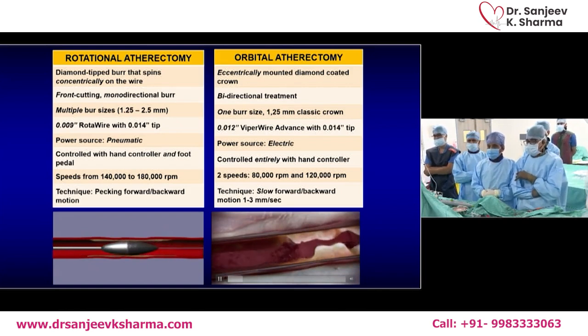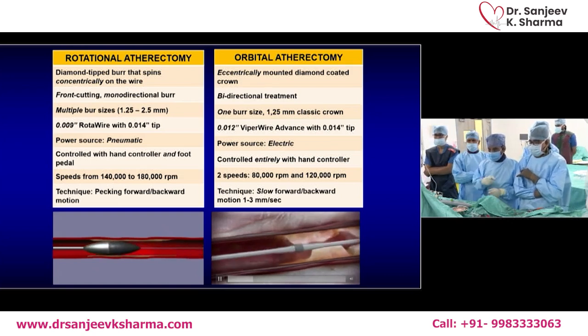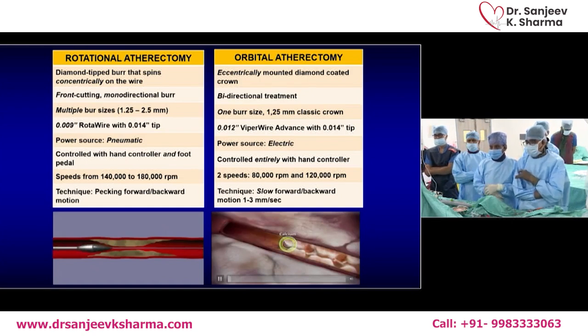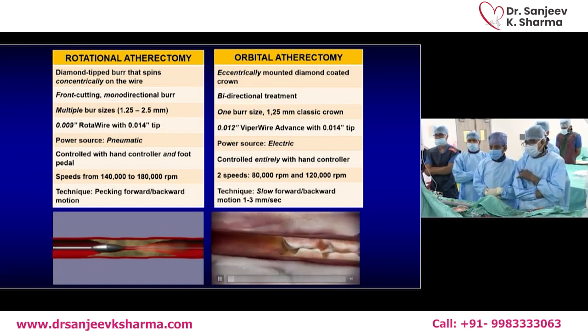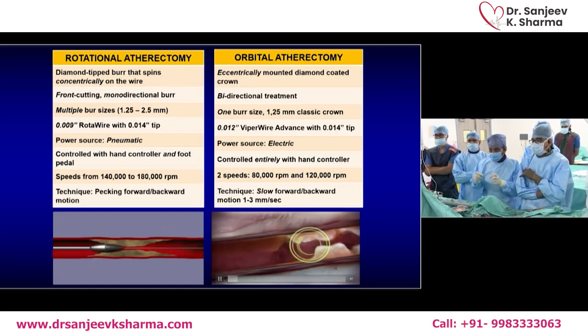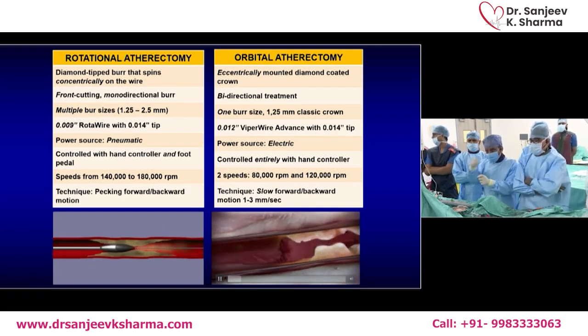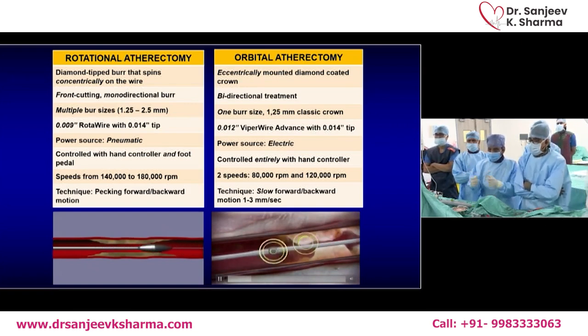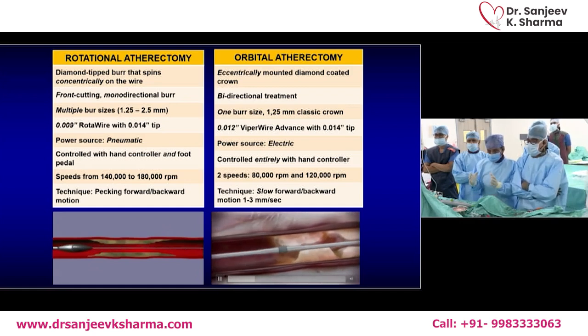So this one is the bidirectional orbital. The name is orbital because it is not only going horizontal, vertical also, and that is speed dependent. Guys, continue to play that. The higher the speed, the more it will turn into the orbit and have better ablation, or sanding as they call it, basically, and the slower speed is less.